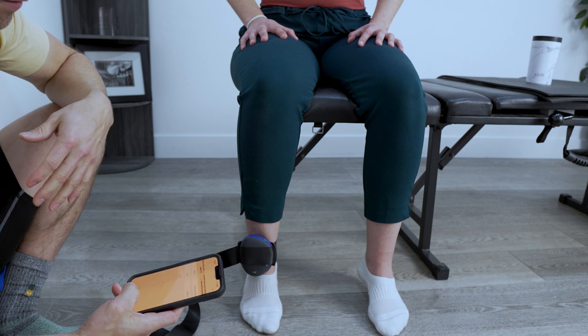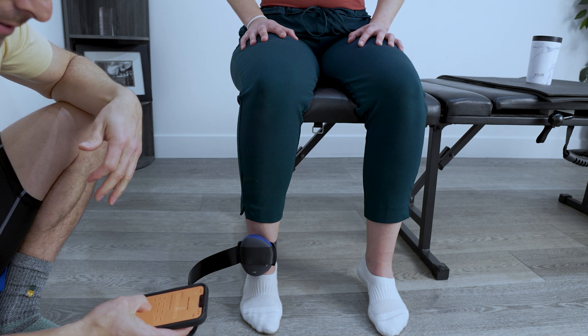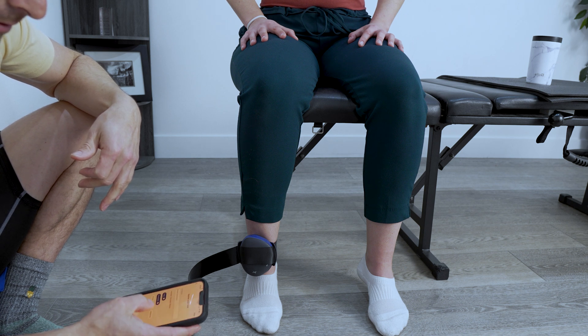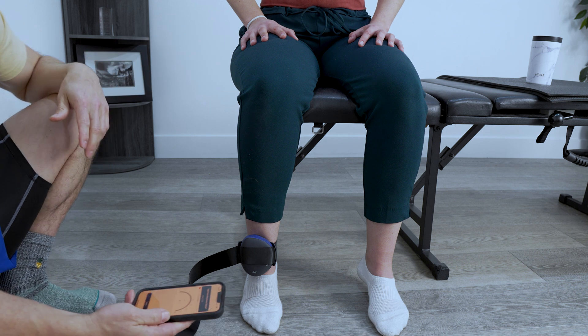We changed out the plate or connector to make sure that we don't beat her shin up. And now we're going to add a measurement — we're only going to do the right side here, at least for this test. We're going to do right side, knee extension, seated. Dawn did not warm up, but let's just see what she got.